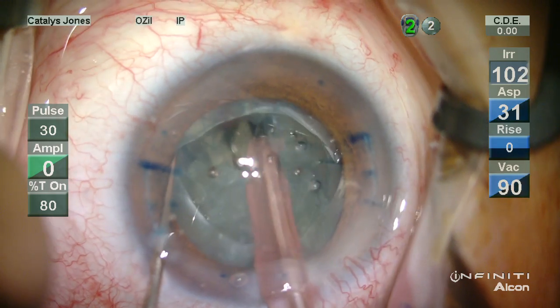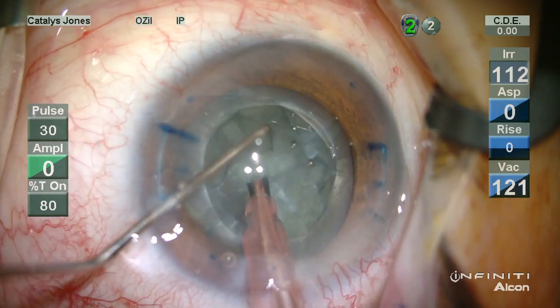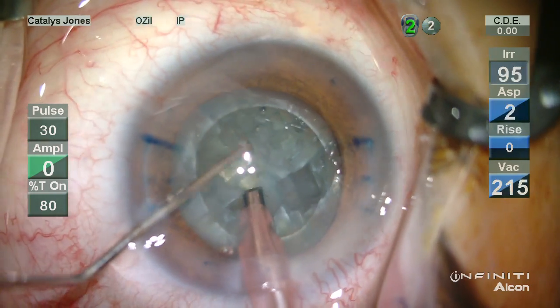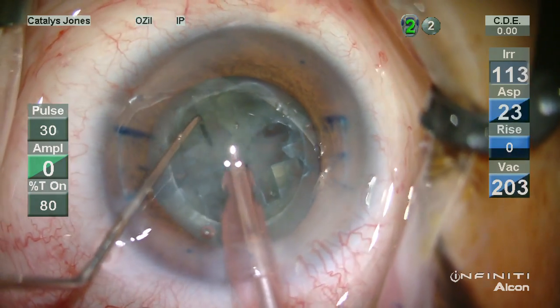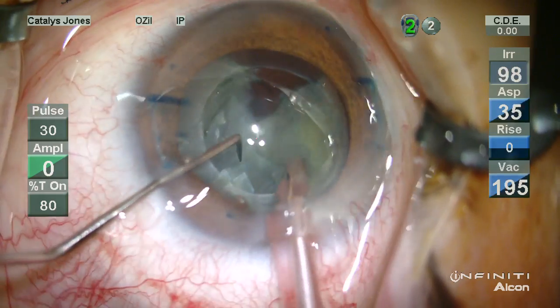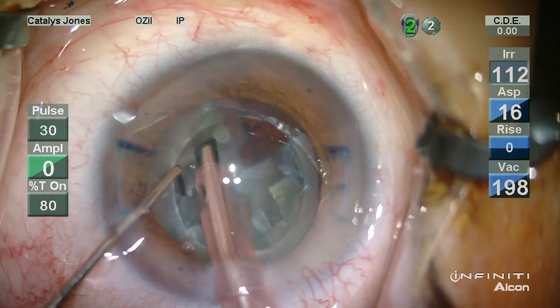These lens cuts are fairly thorough in terms of sectioning the cataract into easily manipulated pieces, both in terms of quadrants as well as smaller 500-micron cubes. The lens cuts themselves don't perform anything horizontally, but the lamellar structure of the natural lens leads to a cube-type formation and more easy evacuation.